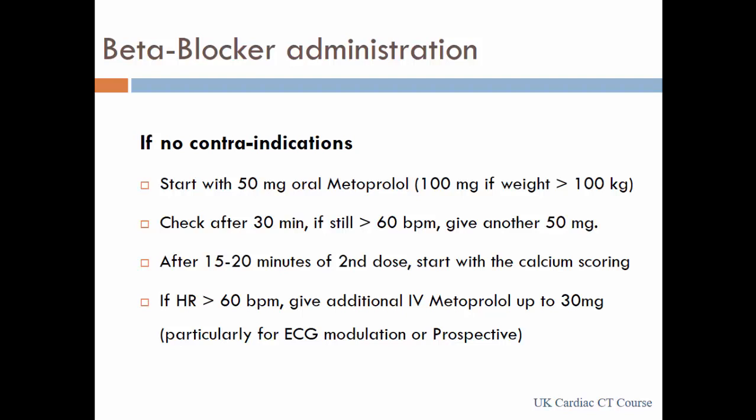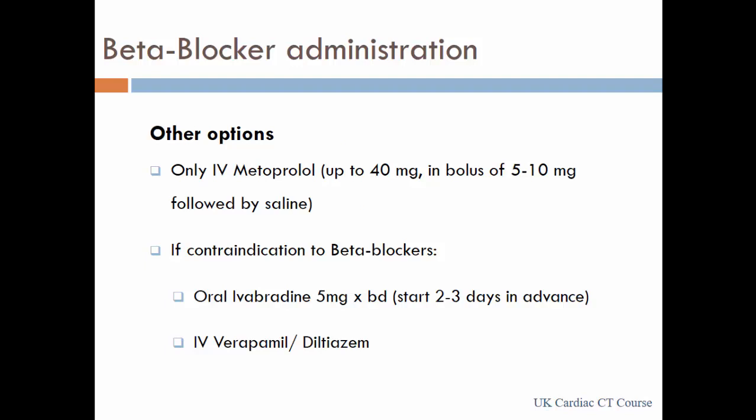For every 10 minutes, my time will be wasted. And also I feel that when we are giving intravenous beta blockade in the scanner, the scanning time is also being wasted, that 10 to 15 minutes of giving them solely intravenous beta blockade. So it's less efficient, I feel. But in terms of effectiveness, it is equally effective.